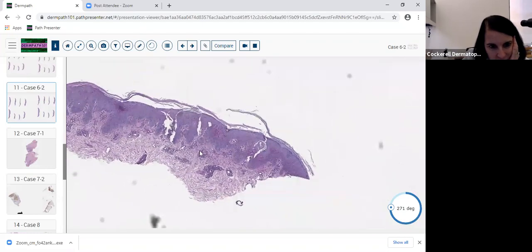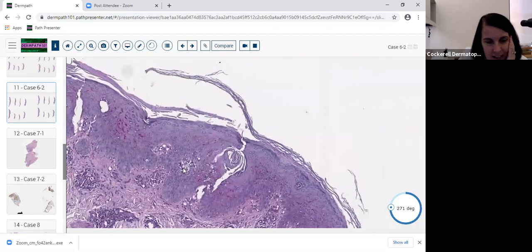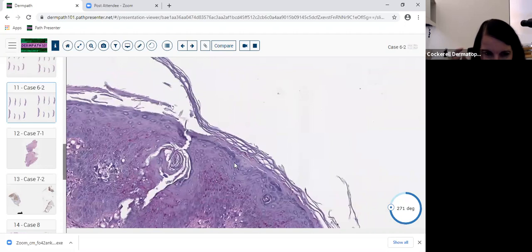So this is tinea infection, dermatomycosis, dermatophytosis. If it's dematiaceous, well, you'll see brown. You know, we showed a tinea nigra the other day. They may show you tinea nigra on the board. I think I had that on my board exam because you could see it so easily because the hyphae were brown. And I showed you one of those that mimics melanoma on the foot. I think I showed one the last time.